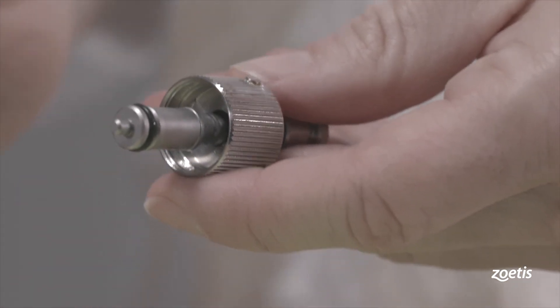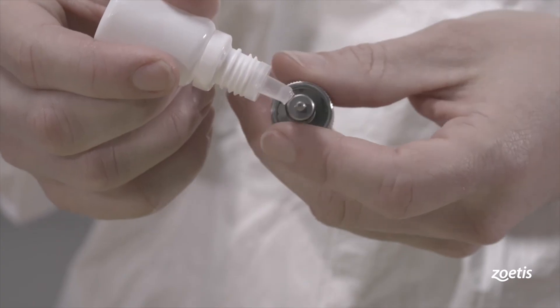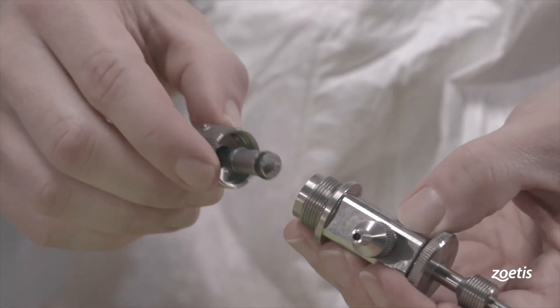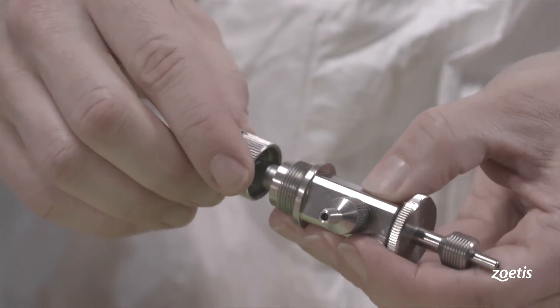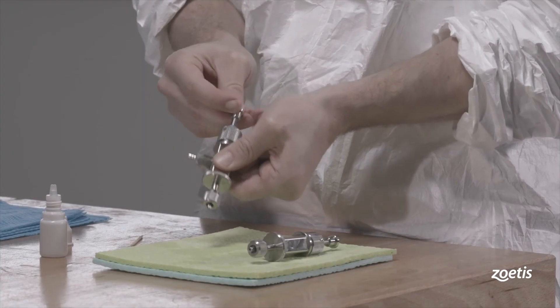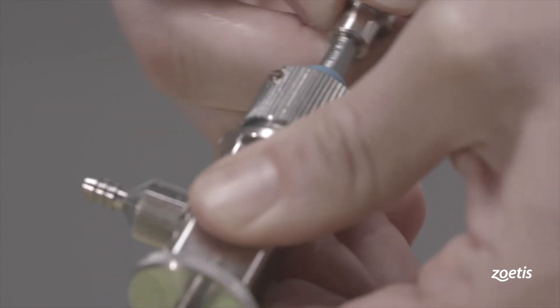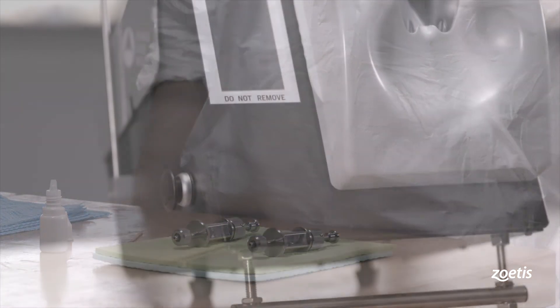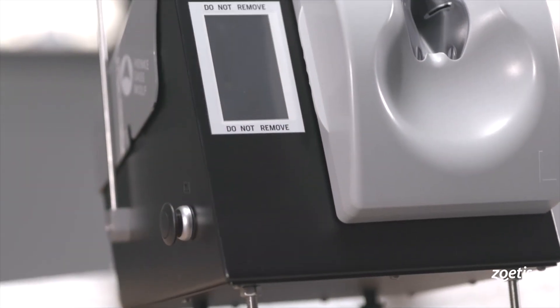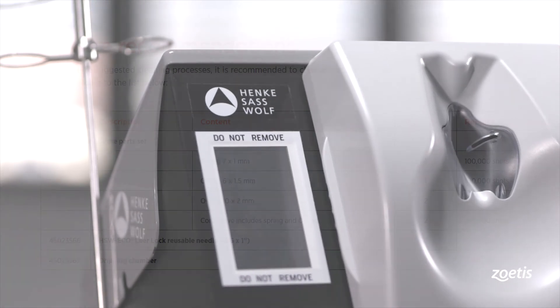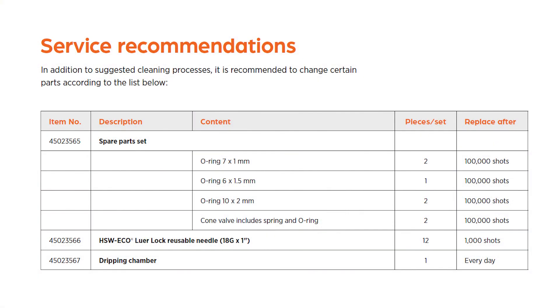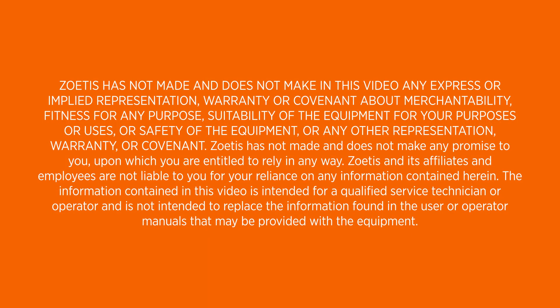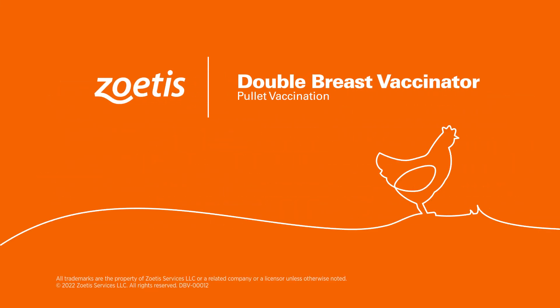Apply a drop of oil to the O-rings on the piston rod. Contact your Zoetis representative with questions. Thank you.